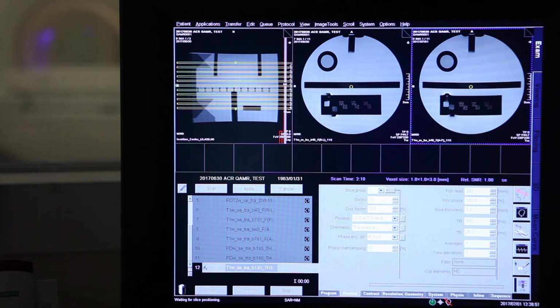So this is important to mention. You have to change the distance factor appropriately, in order to increase the gap between the slices, to put the sequence at specific locations. So we leave enough space to accommodate thicker slices, exactly, at the next sequences. You're right. That's the 3 millimeter slice thickness.